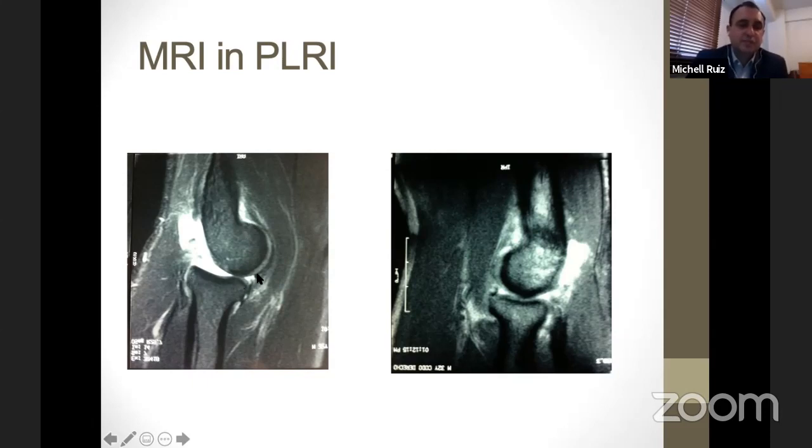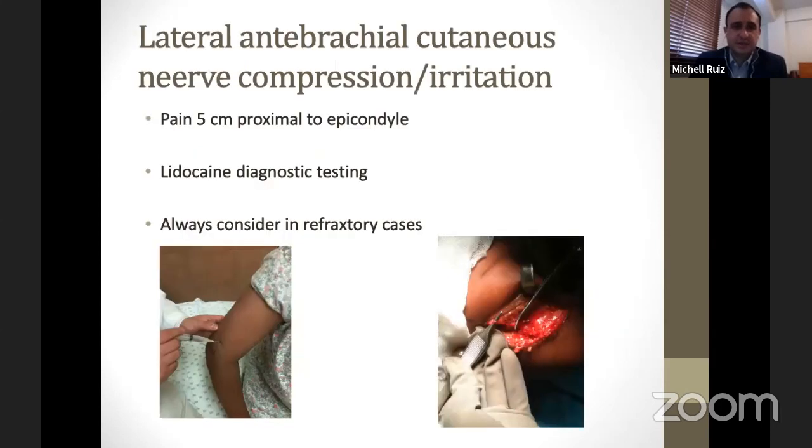The patients will have this posterior subluxation of the radial head, and they will have to go with the arm in pronation just to have a recentering of the arm. But if the patients are willing to go through this exam, doing first the sagittal slices with the elbow in supination and then doing the forearm in pronation, you will have these two very significant images that are going to confirm the presence of a posterolateral rotatory instability. I always try to explain to my patients what we are going to experience with the exam and the relevance and importance of these findings.